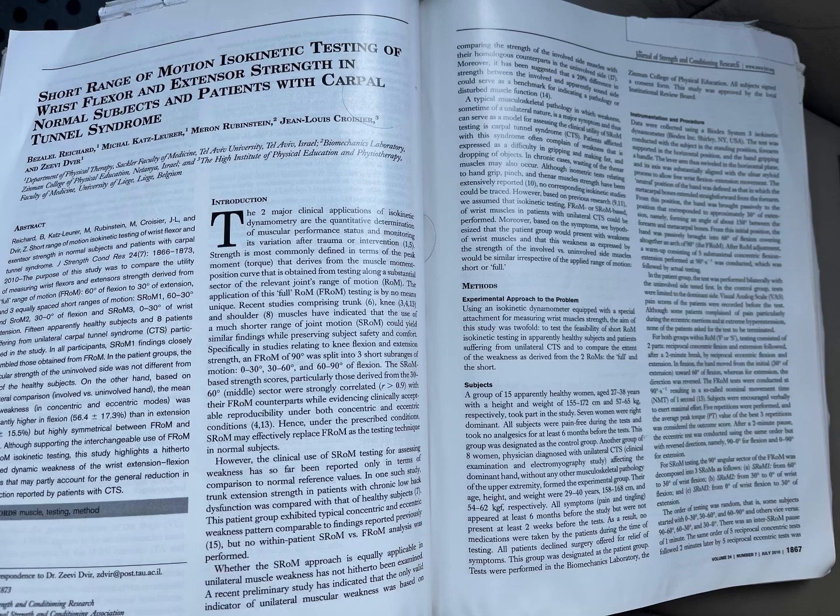For FRoM, after RoM adjustment, a warm-up consisting of 5 submaximal concentric flexion-extensions performed at 90 degrees per second was conducted, which was followed by actual testing. In the patient group, the test was performed bilaterally with the uninvolved side tested first. In the control group, tests were limited to the dominant side.